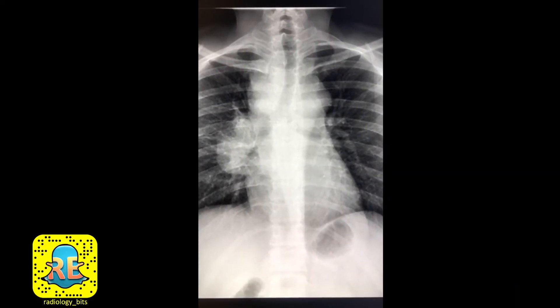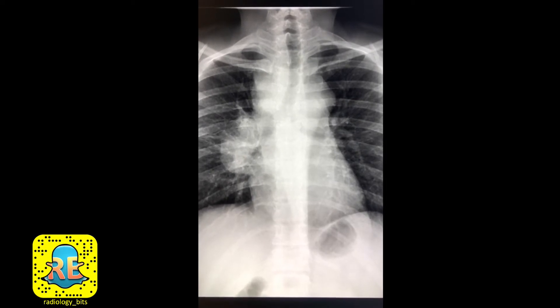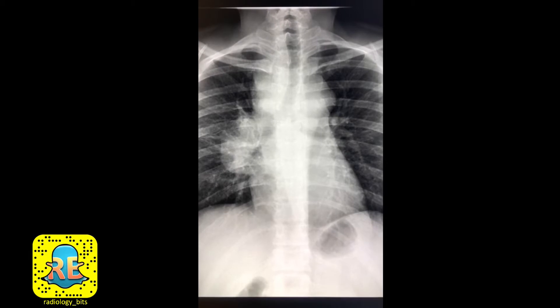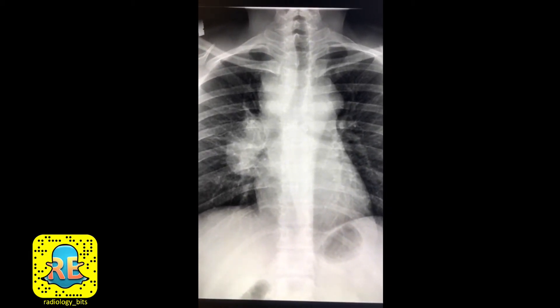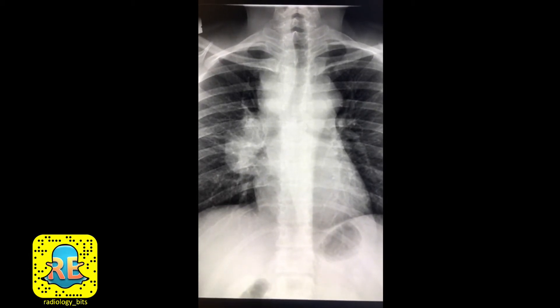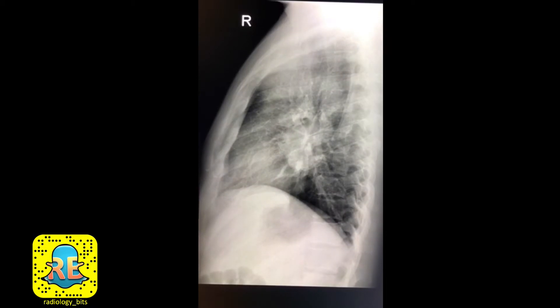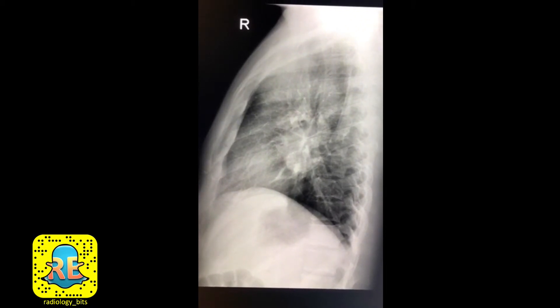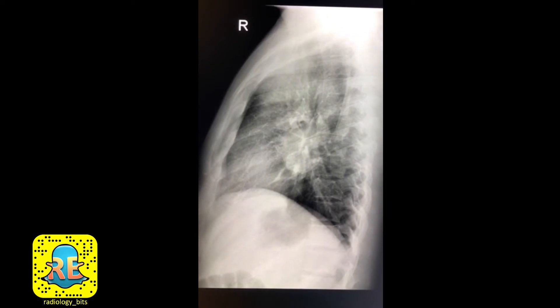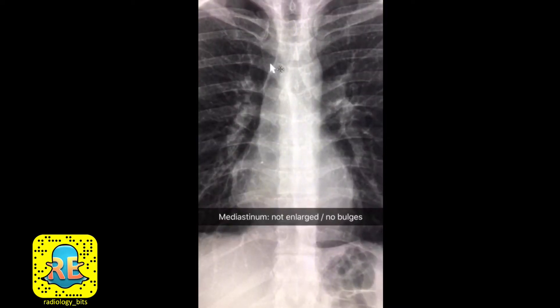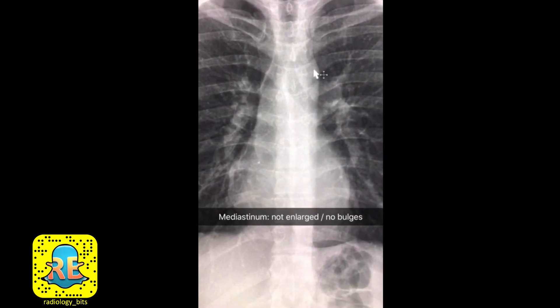Welcome again everybody. It's been a while since we saw chest cases, so let's take this case to review a few important points. This is a 31-year-old male patient who presents with shortness of breath and fatigability. This is his lateral chest radiograph. Let's look at a normal case before we proceed with the abnormal one.